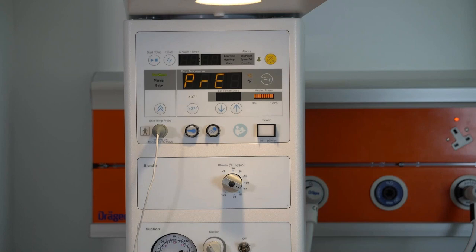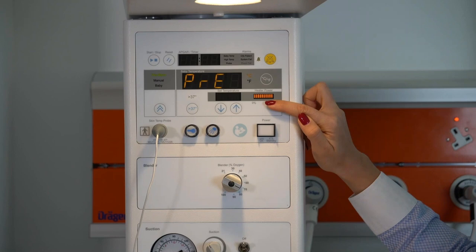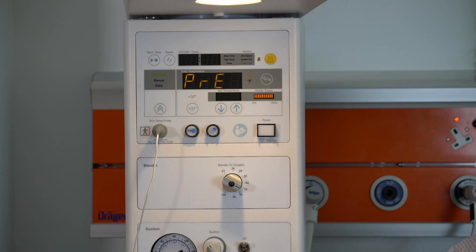And what does it mean from the clinical protocol? Whenever you know that you have a critical baby that might require resuscitation, or in any other case, what we recommend is to turn on the device, and the device will start in the pre-warming mode. So we see that we run at 100% output, and it's warming up the elements, and we are warming up the patient bed. So basically, we are making sure that when the baby is delivered, it's delivered to the warm space to avoid, first of all, the conductive heat loss, to what Linda was referring, and also the radiative heat loss from the cooler temperatures in the labor and delivery wards.